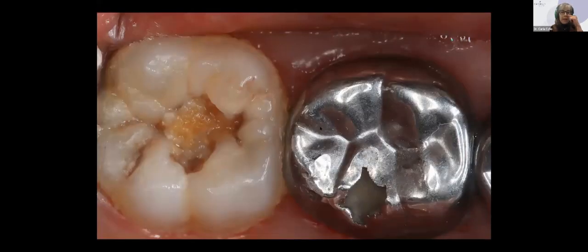Well, look at this little fellow here. This is a 6-year molar. He's about 7 years of age. He's also a special needs patient with a very, very deep decay. So we had ended up putting off treatment of this lesion for far too long, hoping that he would become cooperative enough to sit in the chair. In the end, he did not.